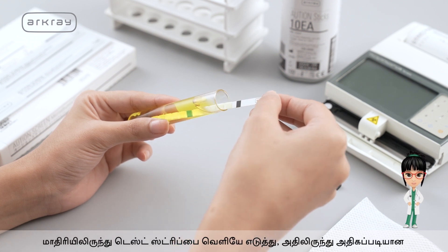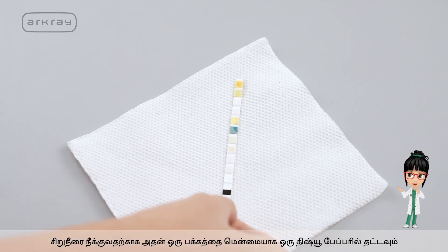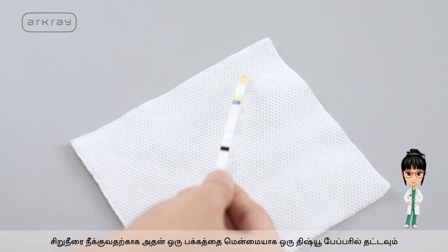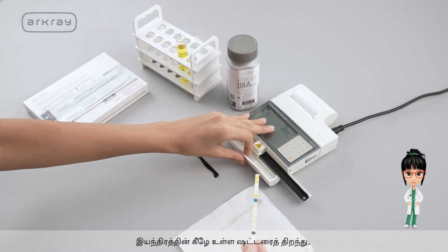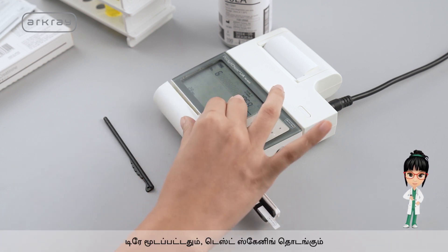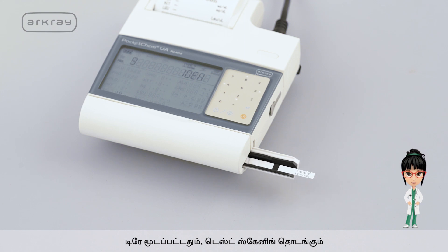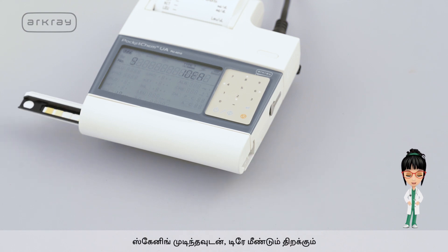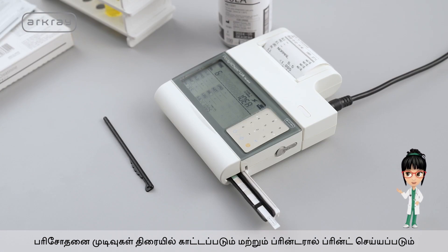Take out the test strip from the sample and gently tap one side on a tissue paper to remove excess urine from it. Open the shutter at the bottom of the machine. Place the test strip on the open tray and close the shutter. As the tray closes, the test scanning starts. As soon as the scanning is over, the test results are displayed on the screen and printed out by the printer.